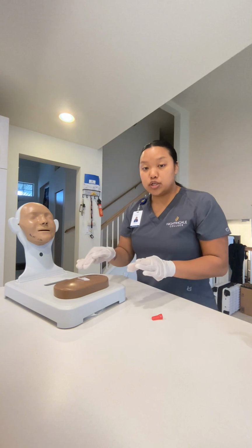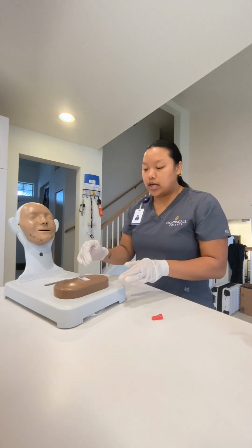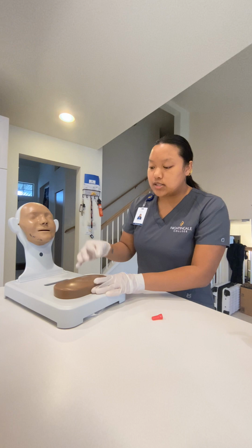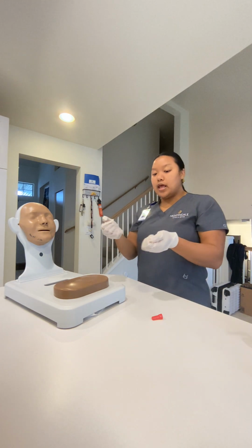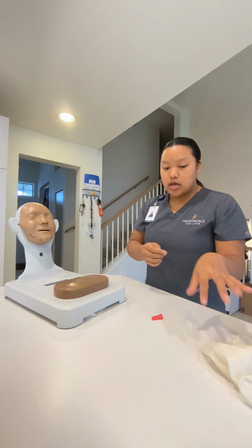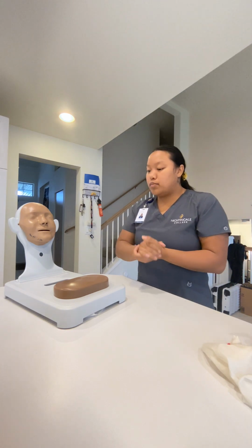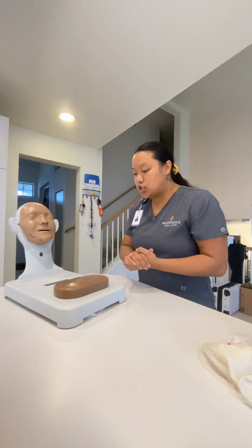I don't wanna push or massage it. We're just cleaning the area and making sure that there's no irritation. So now there's no bleeding or anything. We're gonna go ahead and take this swab off, toss it in the trash. And then now I'm gonna go ahead and take off my gloves, throw all my trash away, get my hand sanitizer on. Okay, Ms. Poma, so we are all done with this subcutaneous injection of heparin.